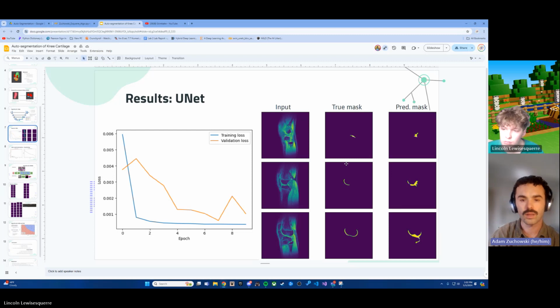On the right, you can see the output from our UNet. The first column shows the slices from the MRI, so that's actual MRI data. The middle one shows the expected mask, which was given to us by people in the MyOB lab who actually went through and segmented all these MRIs manually. The last column shows the predicted masks. We can see that it matches pretty closely, but there are definitely some places where the model's still making mistakes, and this was about 98% accurate.